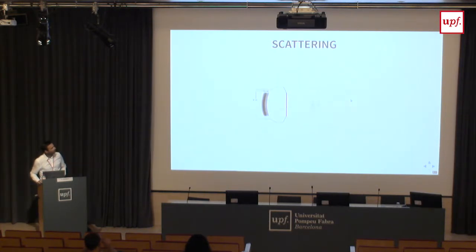And this is also important because if instead of just one, you have multiple targets, as in this case, by focusing your wave adequately, and by choosing the line where you want to scan, most of the signal will come from here. So you won't capture this using this specific wave, and this gives us lateral resolution. So it will give you the ability to resolve in the lateral direction, which is this direction here.